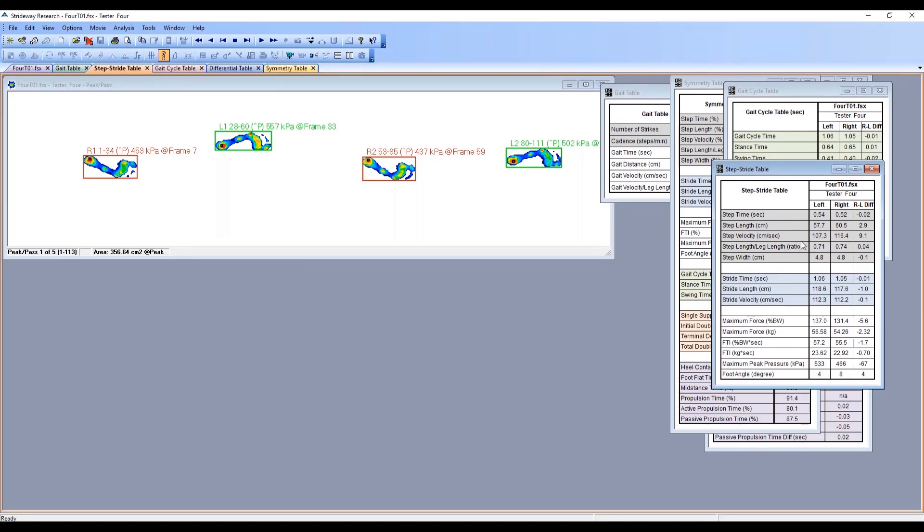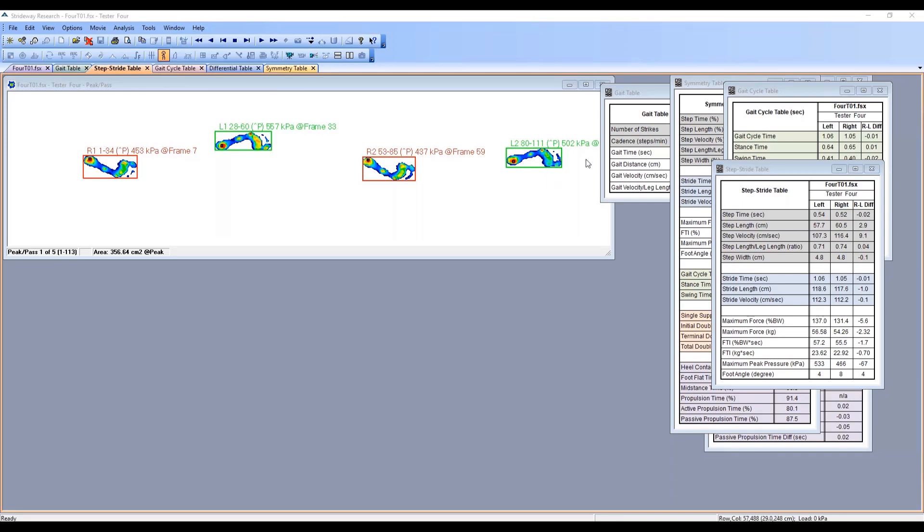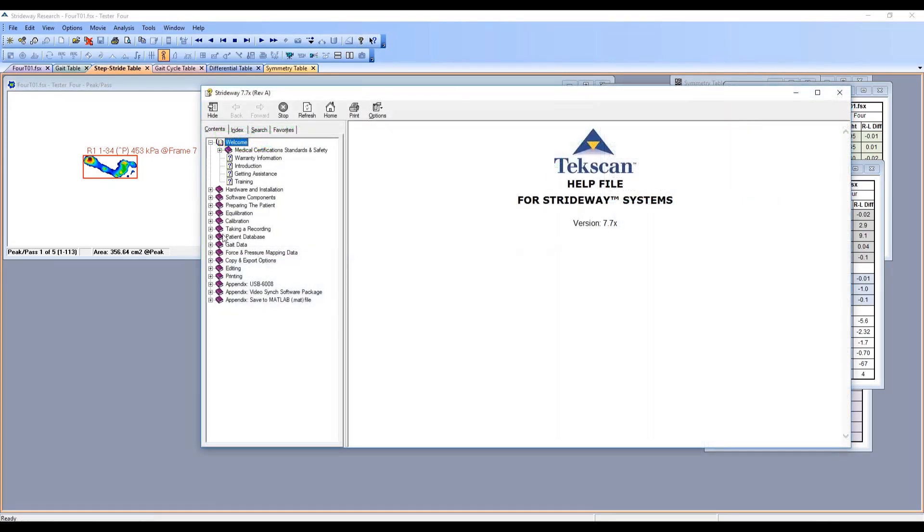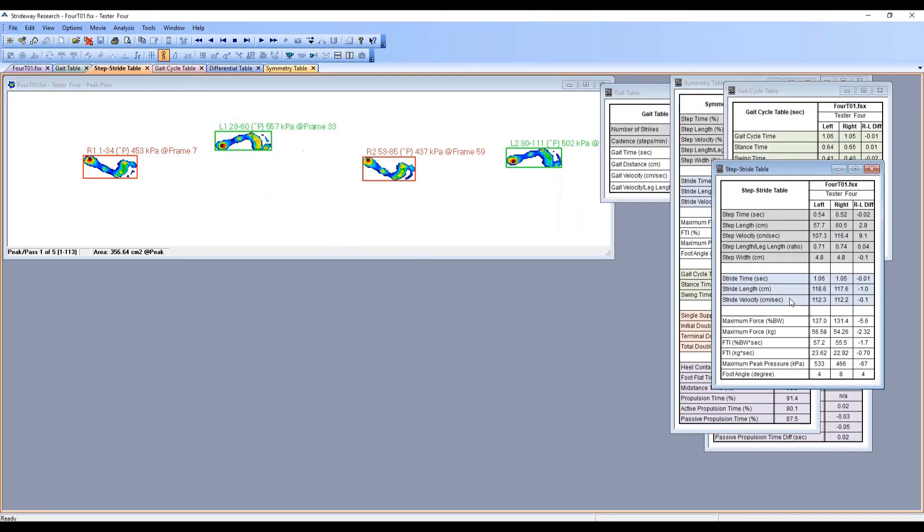If you want to look at the exact definitions of how these parameters are calculated, I would point you towards the help file. It will have all the definitions in there that will give you all the calculations.